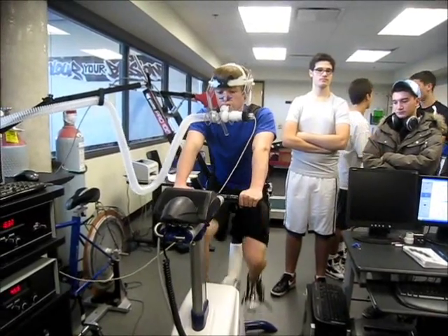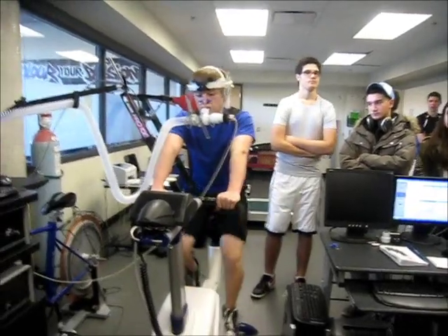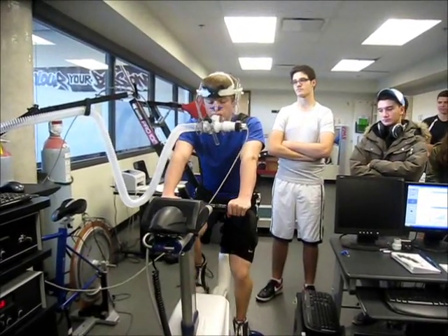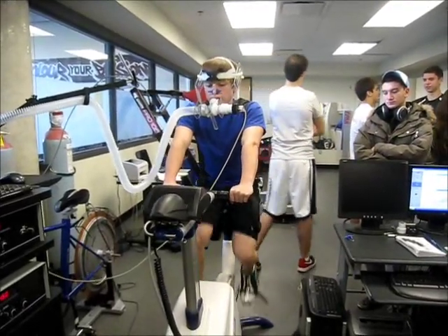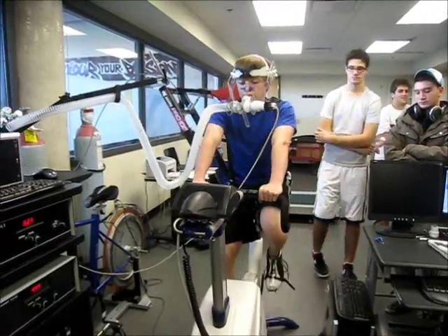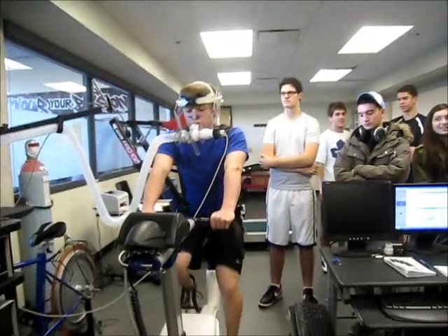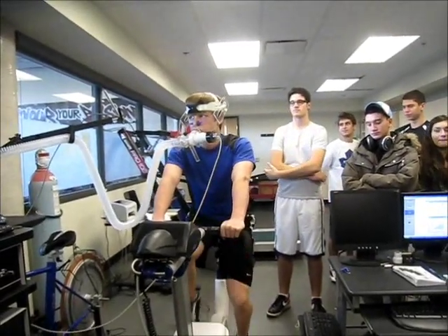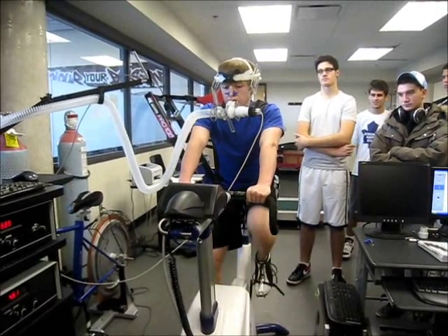It's more of a hyperventilating thing. Even though you don't think you're nervous, subconsciously your heart rate's higher and things like that. The same often happens with heart rate — before the test starts it can be high if you're a little nervous, but once the test goes it drops down and then starts to climb again. His heart rate signal is coming in and out a bit — that's the blue line — so ignore those drops; that's just lost signal.